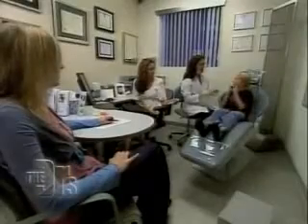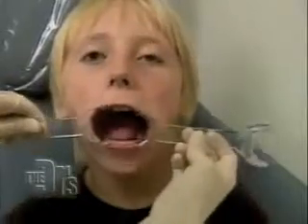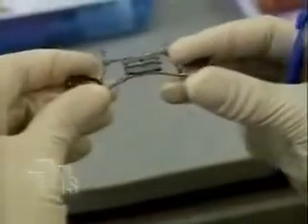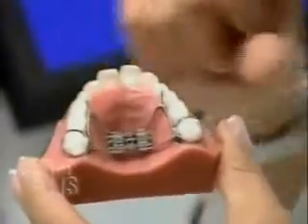Hi, John. So you know why you're here today? To get the expanders. Fantastic. He has a lot of crowding, especially on the bottom. There's a tooth that is coming in. On top, the upper jaw is not developing really well. So he's going to get an upper expander and a lower expander too. When we do the jaw expansion, the upper jaw actually gets wider, and we create more room for a lot of the permanent teeth that are coming in.